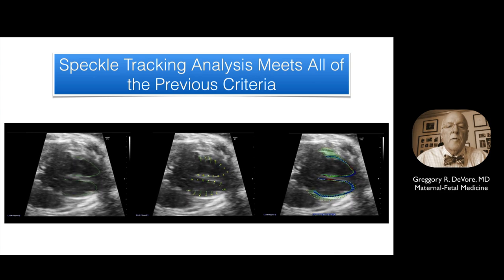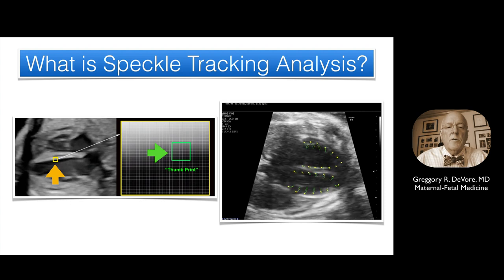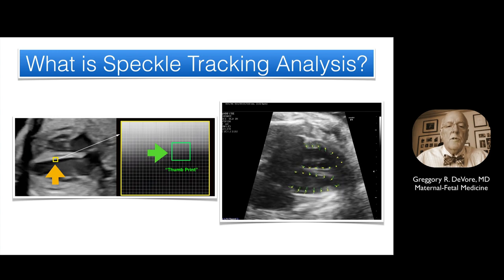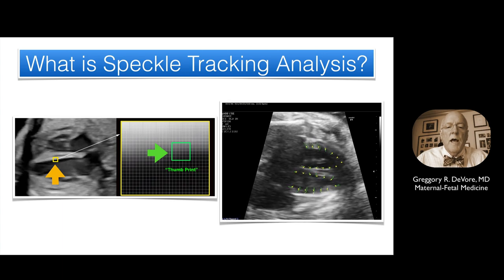Let's now explore this new diagnostic tool developed for fetal use. Using the right ventricle as an example, the user simply places the cursor at the base of the ventricle at points one and two, and at the apex at point three. This activates the TomTec software to compute the endocardial borders at end systole and end diastole. Once the yellow lines identify the contour of the endocardium, the user can adjust each point as needed. The endocardium of each ventricle is composed of digital speckles of various shades of gray and intensity, which can be tracked by computer software as the ventricles contract.